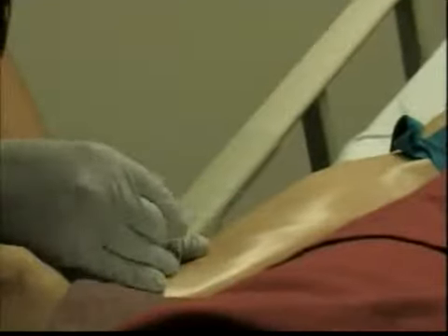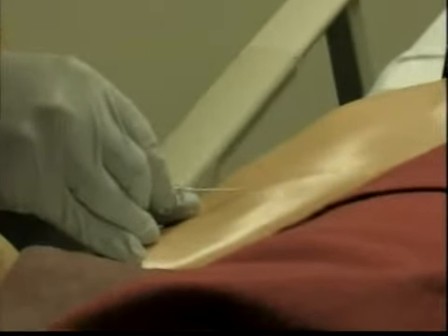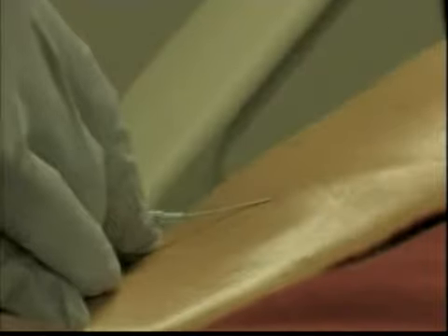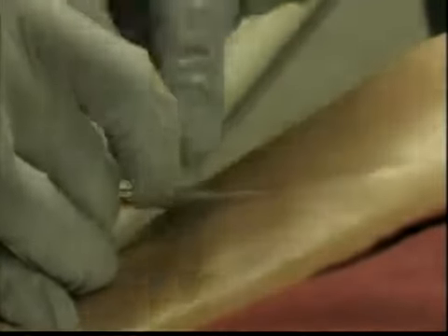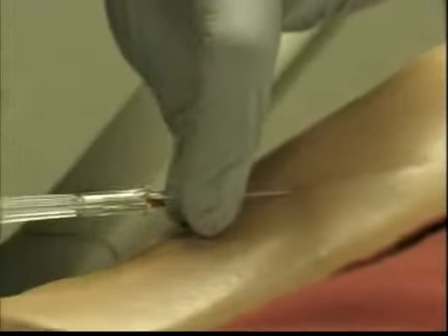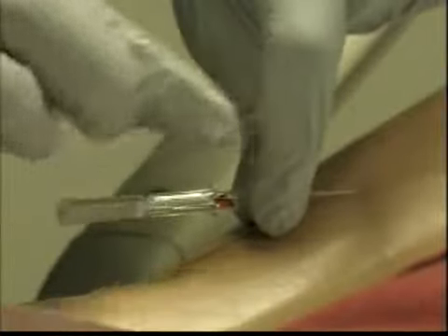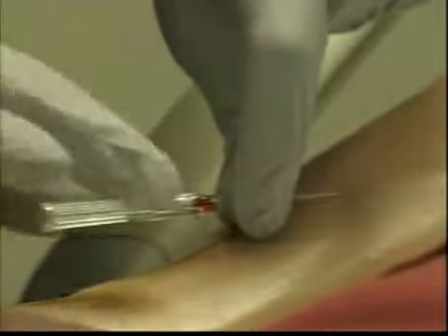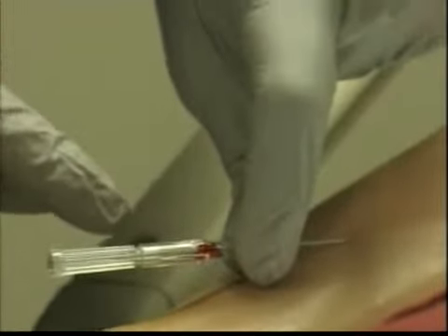You get your bevel up, needle at about a 10-degree angle, and you puncture. You actually tell the patient, I'm going to puncture, and you get it, and you start seeing your flashback. Look what I do with my fingers. I'm holding the hub with my index and my thumb, and I'm lifting the other 3 fingers up. You see how the chamber is filling with blood?